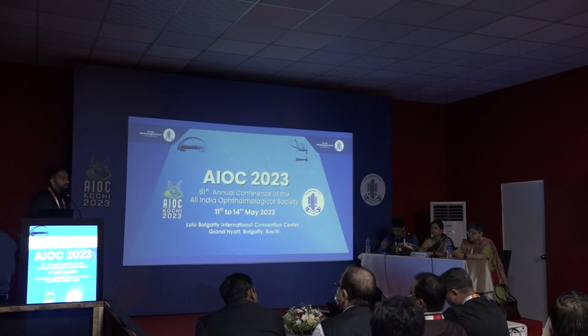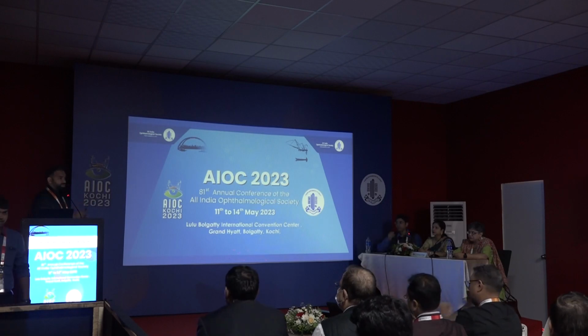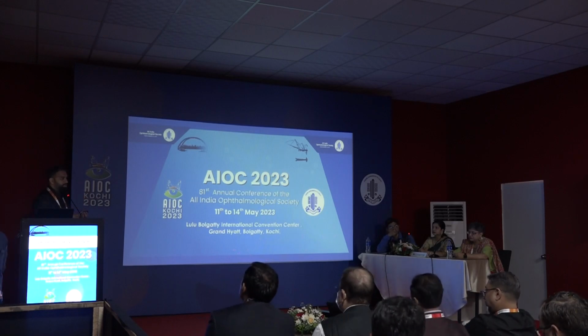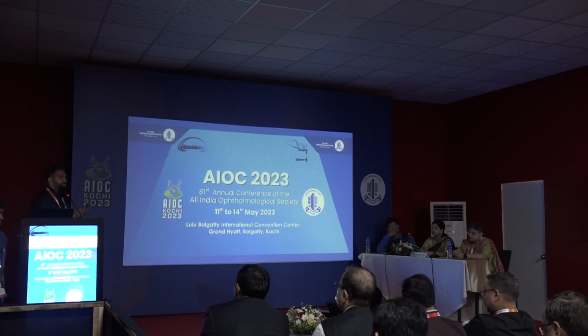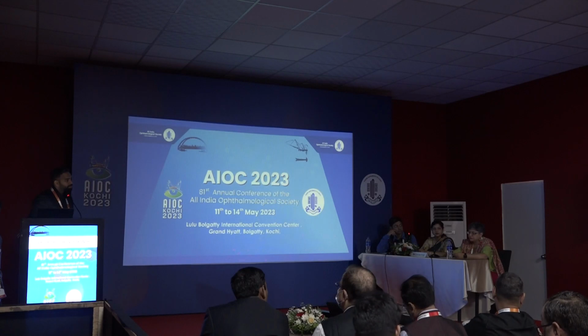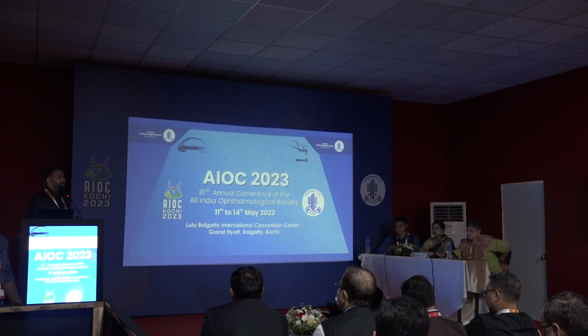The illumination. Can you adjust the brightness of the illumination? At this point, we cannot actually adjust the illumination, but we can use a filter, which would reduce the illumination. The question is, have you ever compared the luminescence of this with that of a conventional one? Yeah, we are doing a study in which we are comparing the LOCS grade of cataract with the slit lamp itself. It's actually very promising.